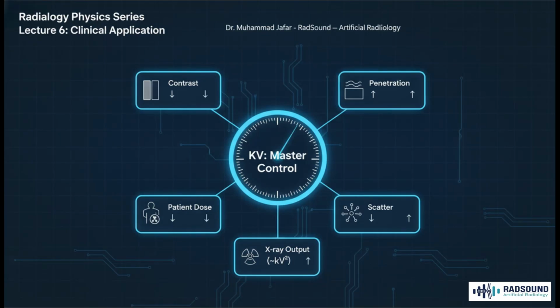Kilovoltage, or kV, is what we call the master control. And you can see why right here. You touch this dial, and you don't just change one thing, you change, well, basically everything. You crank up the kV, sure, you get better penetration, and you actually lower the patient dose. But, and it's a big but, you get lower contrast and way more scatter. It's a constant balancing act.